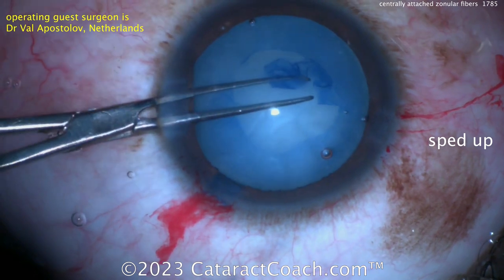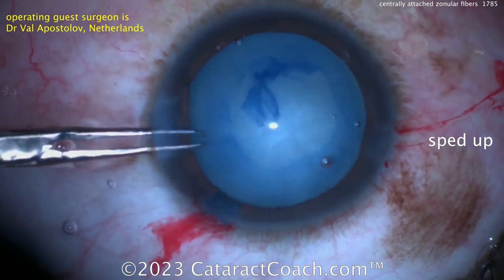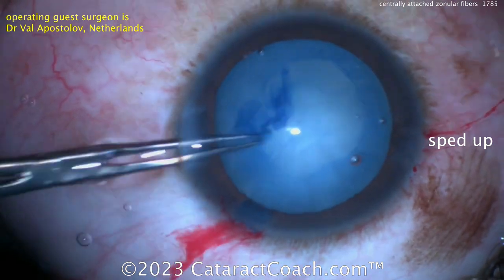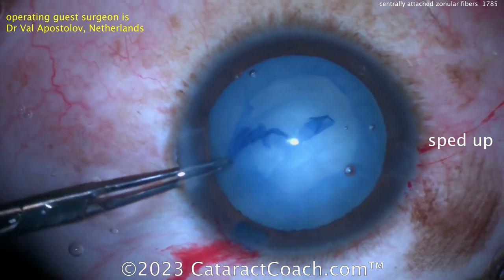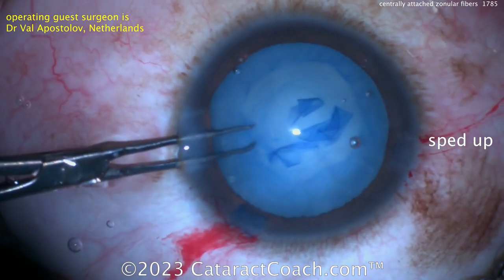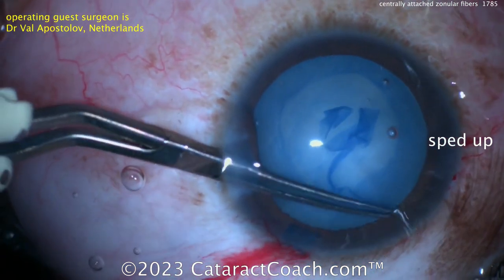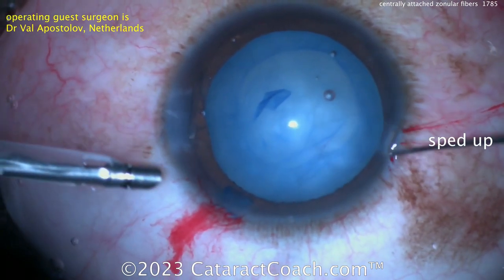I think that'll be okay. Continuing and finishing it right there, pulling it in — very nicely done and completing it. In this kind of case, lucky this cataract doesn't appear to be too dense, and our guest surgeon is obviously very experienced. Now that you've got that rhexis, trying to make it as big as you can and just take what you can get. Just trying to make it that maximal size.